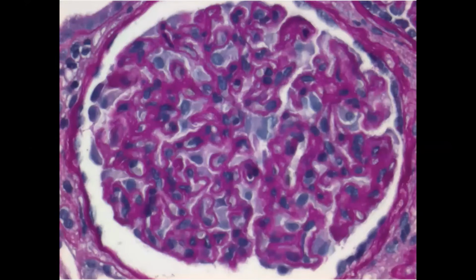Okay, Sherry, you gave us a diagnosis but not the findings. Yes. Good, very good. So we have thickening of the glomerular basement membrane. Very good. Our loops are thickened but we have no hypercellularity. There is no endocapillary hypercellularity and no mesangial hypercellularity. Another thing: we have activated podocytes.